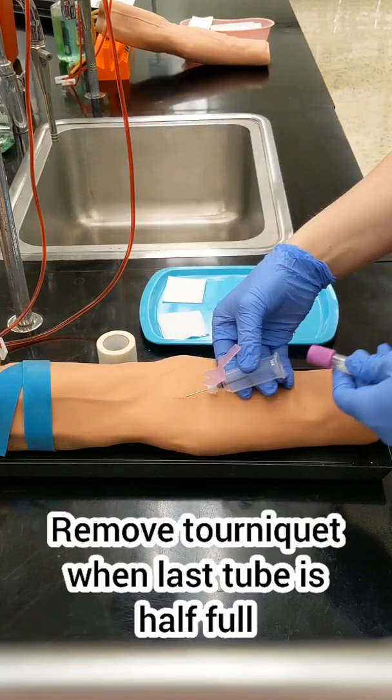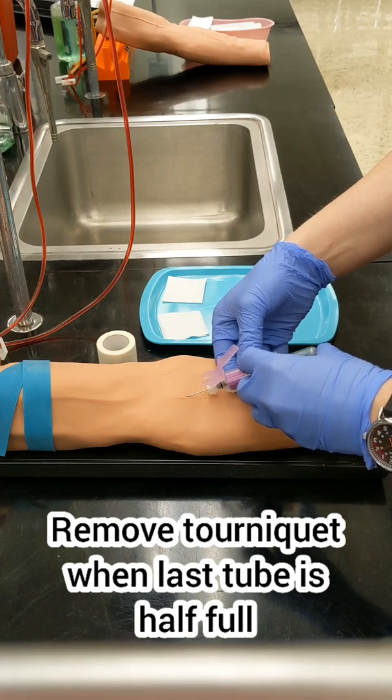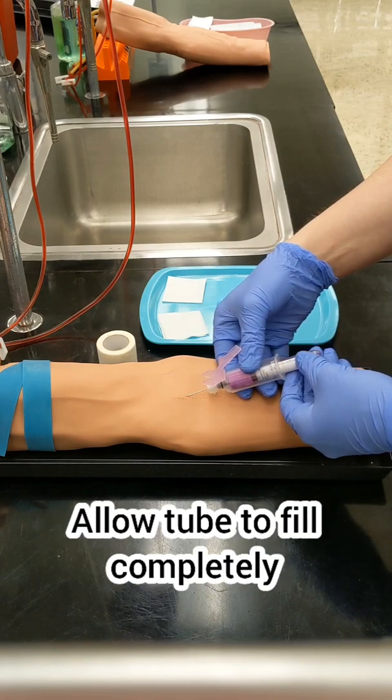Now is a good time to check in on your patient. If they aren't doing well, you need to stop, have them lay down, have a drink of water, and put a cool towel on their neck.